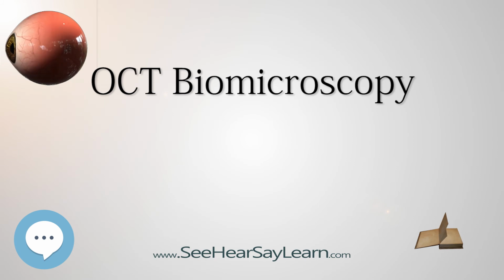The development of short external cavity tunable laser technology has made SS-OCT biomicroscopy possible by combining high-speed acquisition with long coherence length and consistently high image quality across the depth of the eye. It is now feasible that properly designed SS-OCT systems could acquire full OCT biomicroscopic data from both eyes of a subject in less than 20 seconds. As with SD-OCT, mirror image artifacts must be removed from SS-OCT systems.